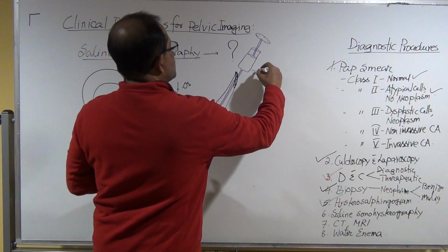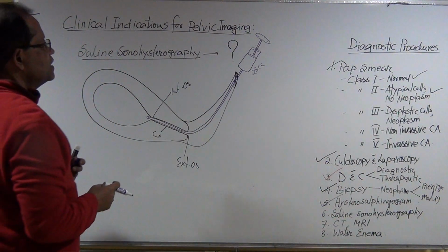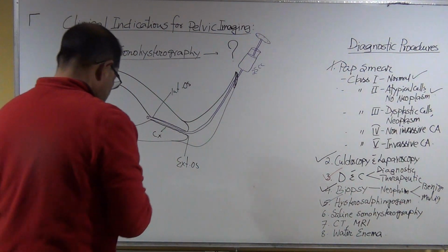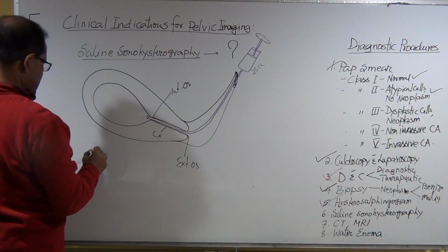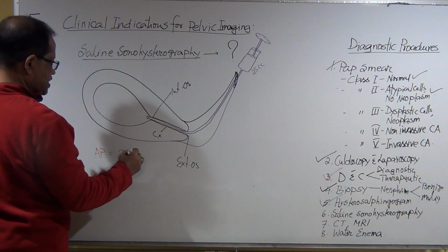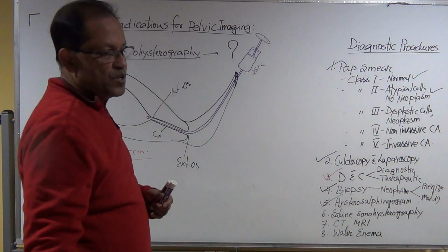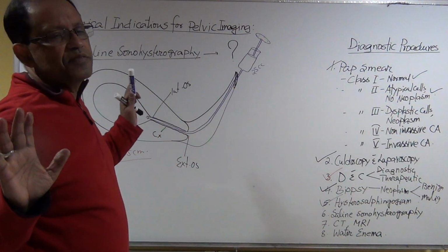Okay, so 25 cc saline water is injected by a syringe and the water is coming inside. Keep that in mind. At the beginning, this is the thickness, like AP measurement is 2.5 centimeter, which is much bigger. Normally it is 1 centimeter, it can go 1.2, 1.3, 1.4. I found 1.5, but it's still fine, no problem.